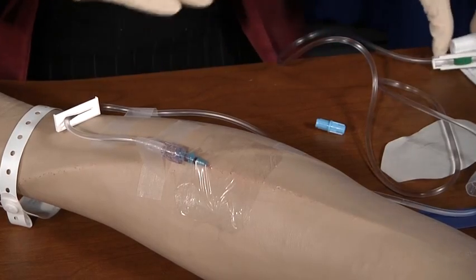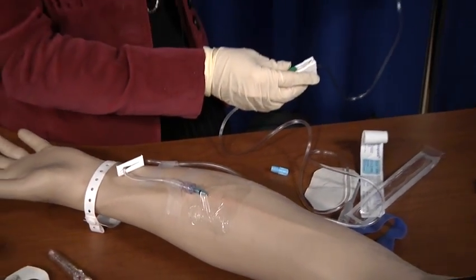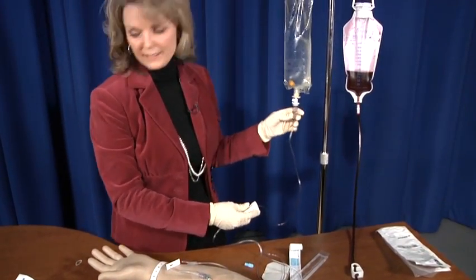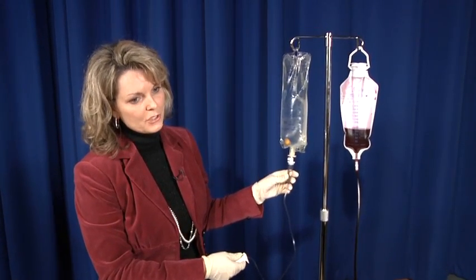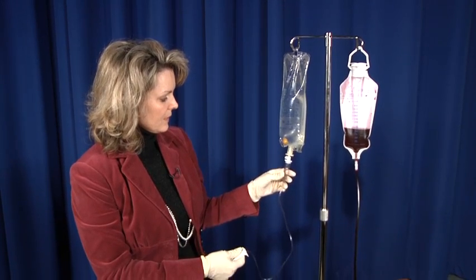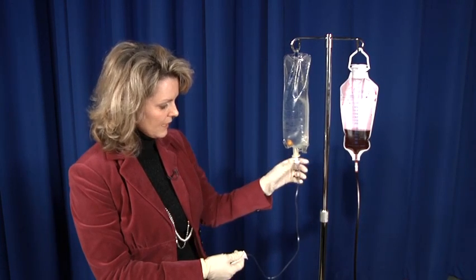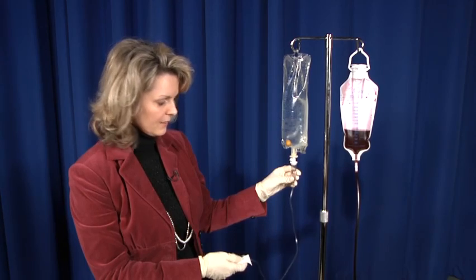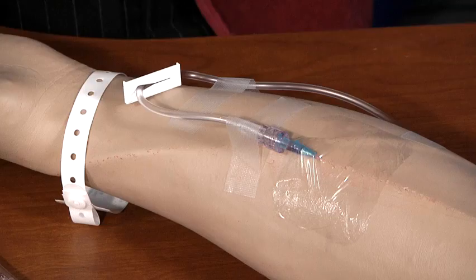All right, so after you've done that, now you are going to actually count the drips. And if you calculated the 150 cc's an hour, it comes out to 38 drops per minute. Again, we're not going to see that on this particular mannequin, but this is when you would count that 38 drops per minute. Once you get it regulated, then you need to come back to your site.